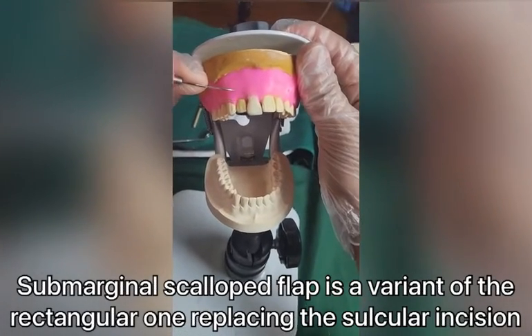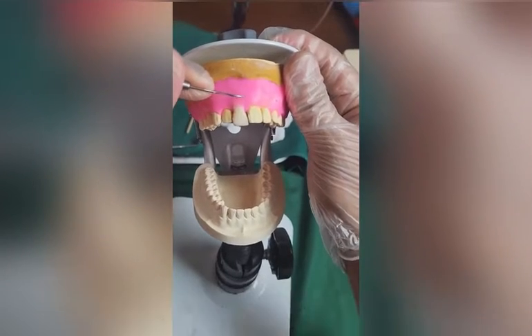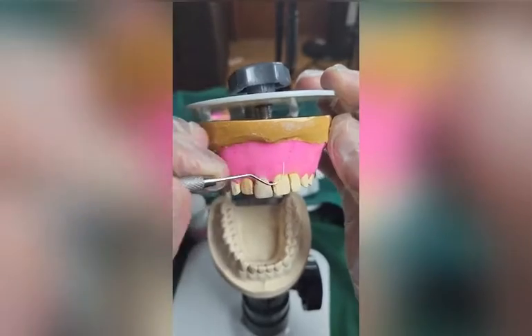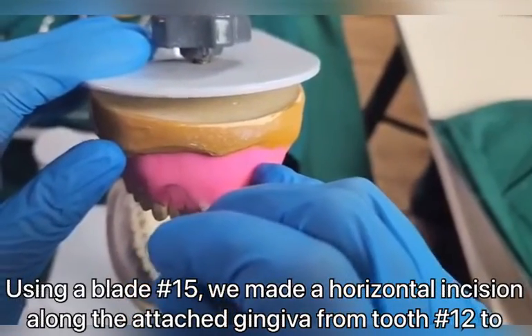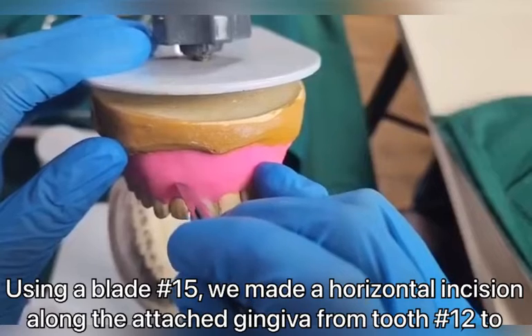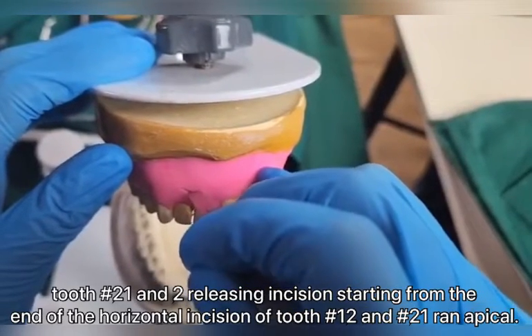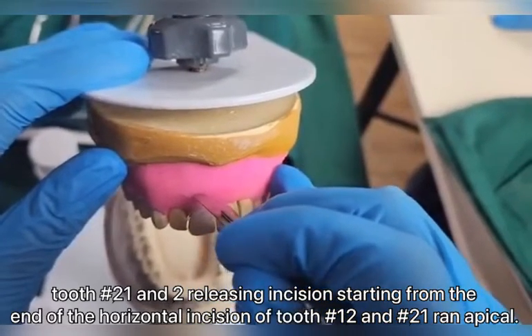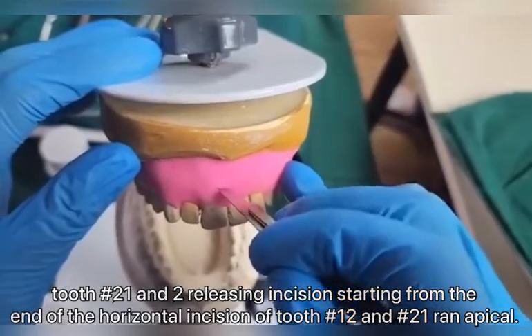Submarginal scallop flap is a variant of the rectangular one, replacing the sulcular incision with the scallop submarginal one. Using a blade number 15, we made the horizontal incision along the attached gingiva from tooth number 12 to tooth number 21 and two releasing incisions starting from the end of the horizontal incisions of tooth number 12 and number 21, run apical.